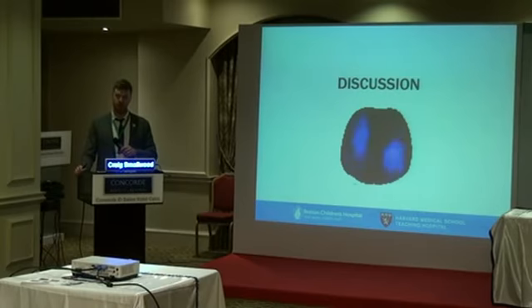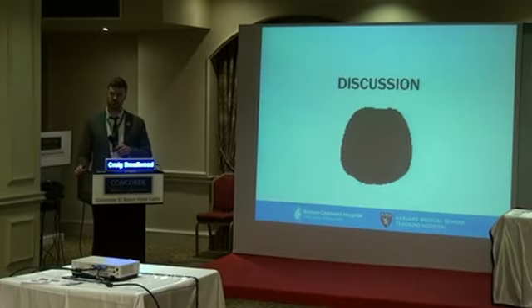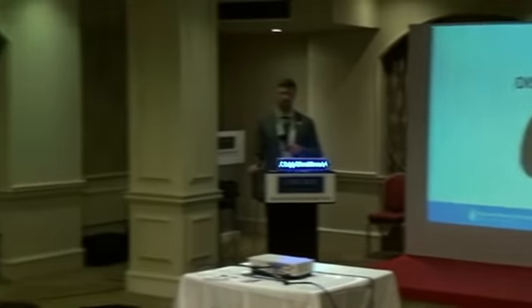I actually have a bunch of questions. Firstly, about the measurements. You can divide the lung into different regions, ventral and dorsal. But the belt makes a cross-sectional image in the lung. It doesn't measure apical or basal simultaneously. I think you have to change the belt, or does it give you an idea about the whole lung from up down? So correct me if I'm wrong, but it sounds like the question you're asking is whether or not you can get cranial caudal? Yes.